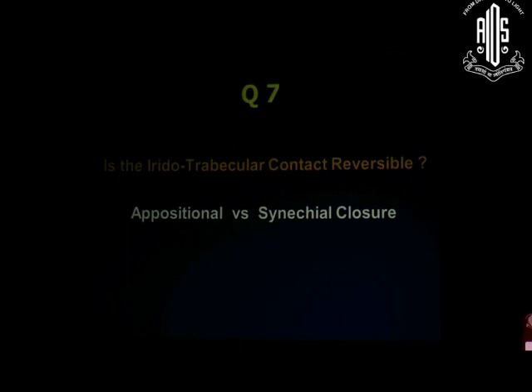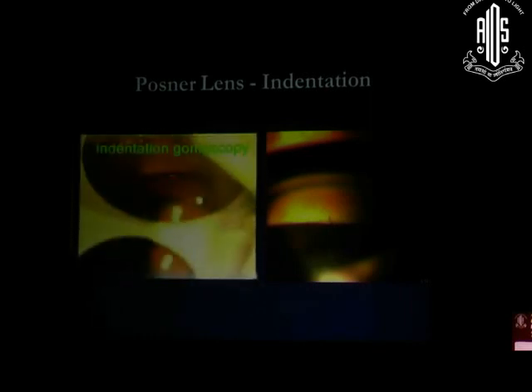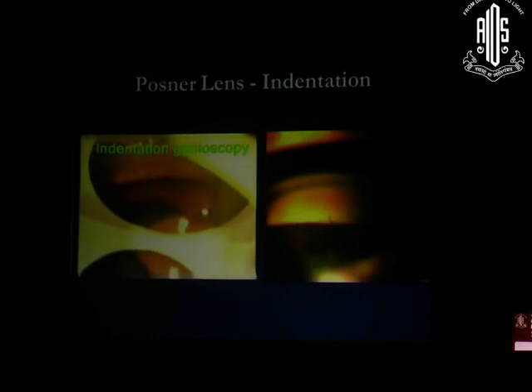Coming to the other critical question: you have diagnosed that the trabecular meshwork is not visible. You have to answer whether this contact between the iris and trabecular meshwork is reversible or irreversible — by irreversible I mean there is synechial closure between the iris and angle structures. See this patient carefully: angle structure was not visible in primary position. Now you ask the patient to look into the mirror — the angle opens up, the scleral spur becomes visible. So in primary position the angle was appearing closed; on manipulation it has opened up. This is appositional closure. This can be done with the Posner or Zeiss lens using indentation gonioscopy — this cannot be done with Goldman-type lenses.